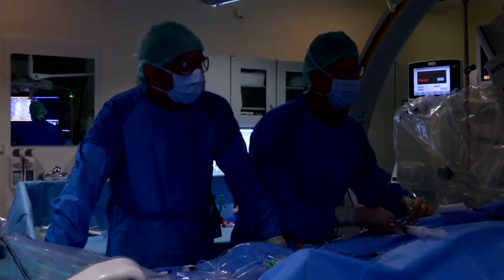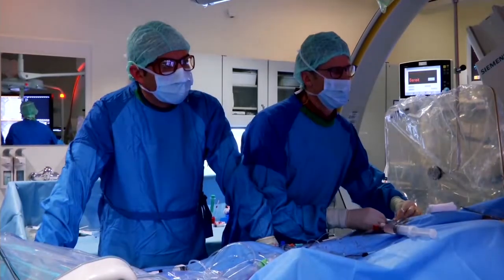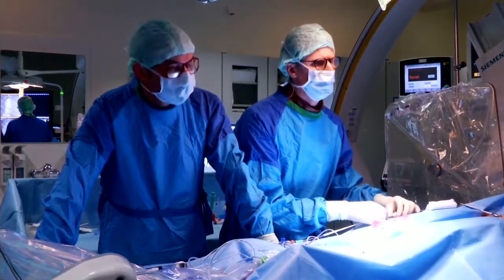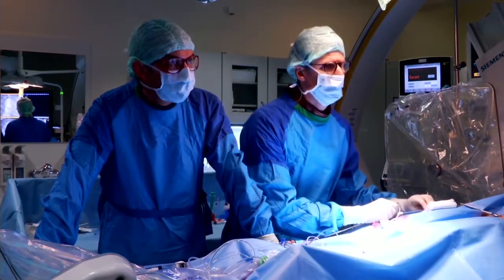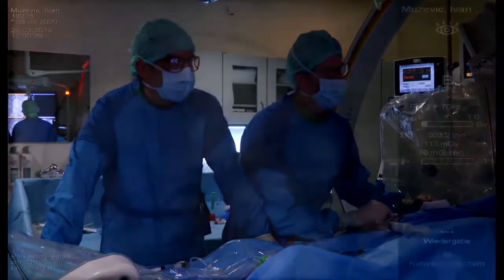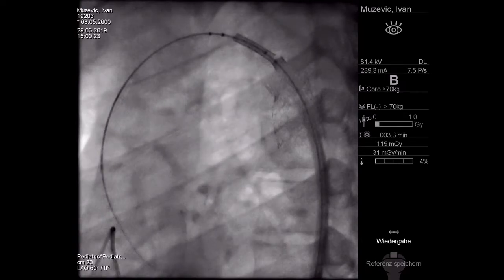I didn't get the question, sorry. Well, the concern I have is that when you start to open the outer balloon, the stent will milk more into the descending aorta, and I wonder how confident you are that it'll stay where it is. How comfortable are you with the asymmetric mounting? I'm not so confident, so therefore I try to push it a little bit more upward, like this perhaps. Are you more comfortable with this now?